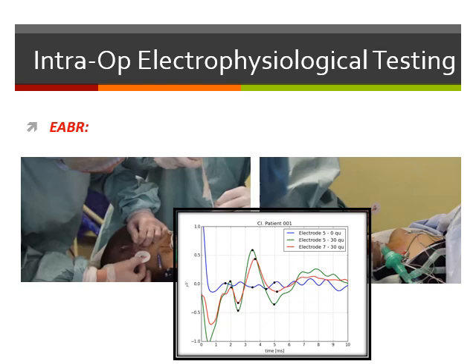Okay, the most important advantage of electric ABR over the ECAP is that the ECAP measures only the spiral ganglion population inside the cochlea or the distal part of the auditory nerve. But here I can test the integrity of the auditory nerve itself. It's very important in questionable cases about whether there is an auditory nerve fiber or not.